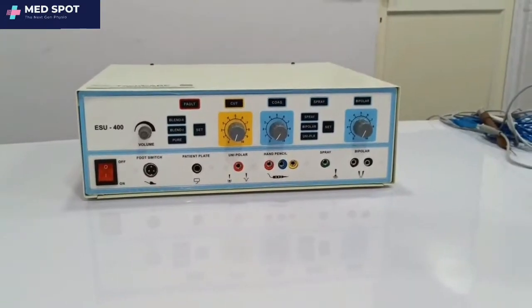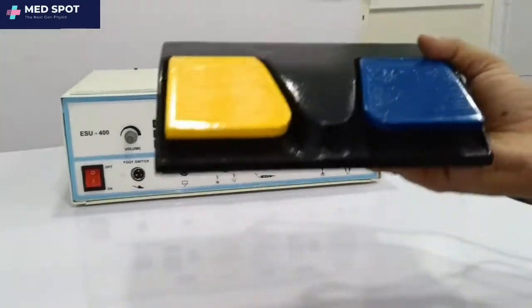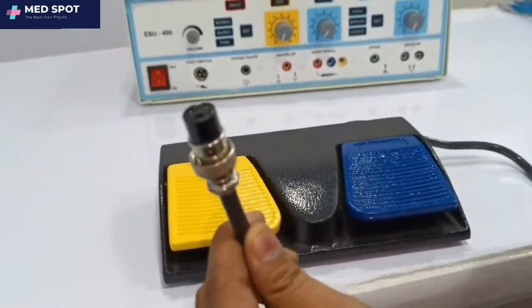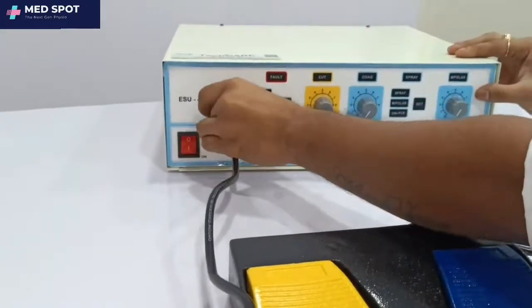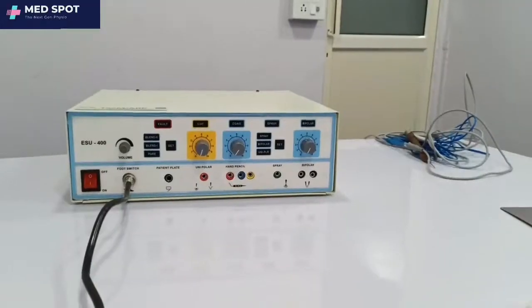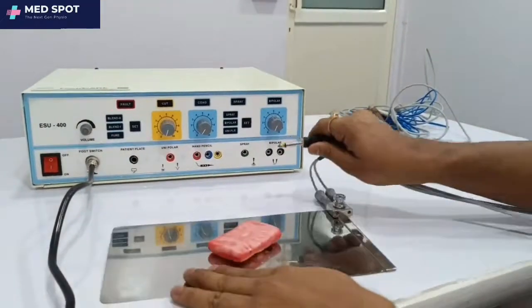The first accessory is the foot switch. This is the foot switch and this is its connector — it connects directly to this port on the device.